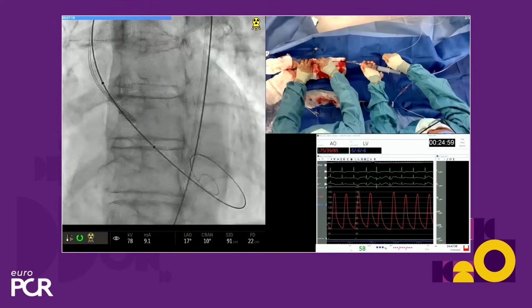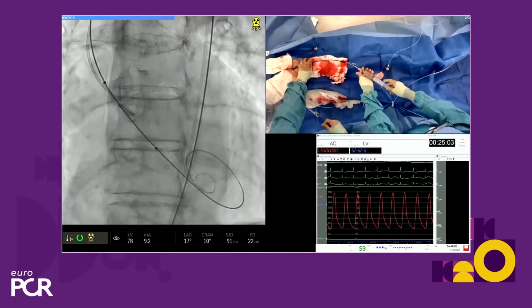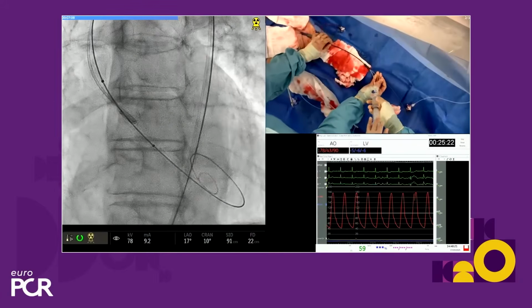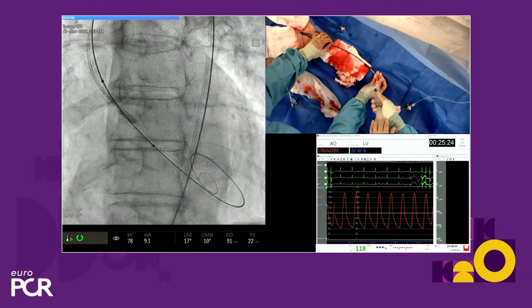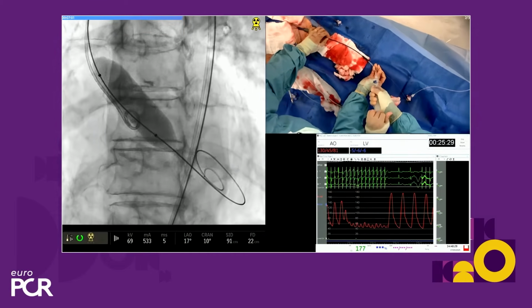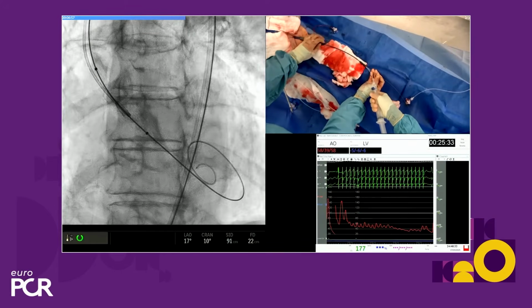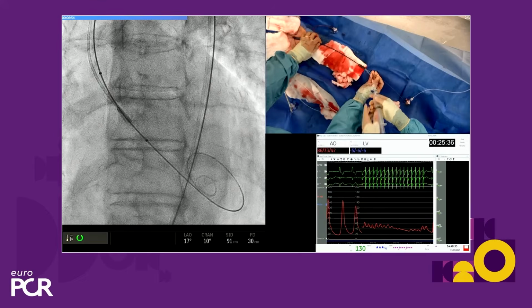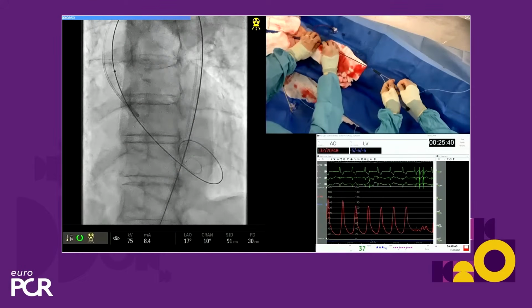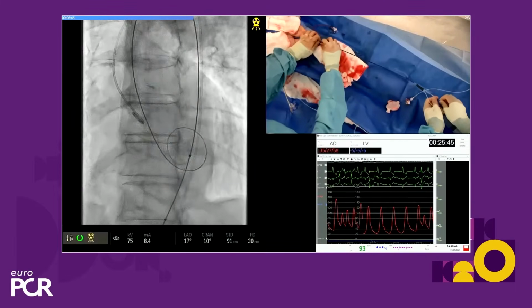For our balloon pre-dilatation, it's important to get an adequate dilatation, and we're going here with a 20 millimetre SIM balloon. So under pacing, and you can see that's a really quite good pre-dil with an adequate position on the balloon. And pressures recovered fairly quickly, though you can see that we've got some broadening of the QRS, so a little bit of bundle branch block there.